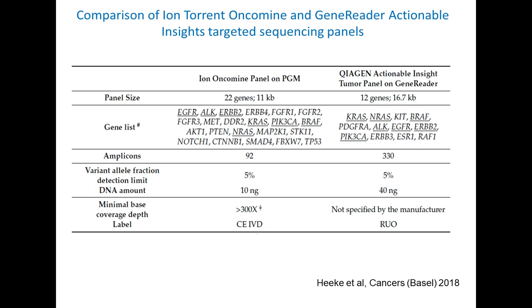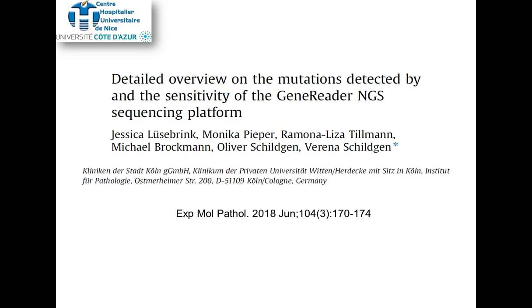However, we highlight 2 points. First, the need of DNA amount is quite much lower when using the Oncomine panel, and currently the Actionable Insights panel is for research use only, while the Ion Oncomine panel is a CE-IVD panel.